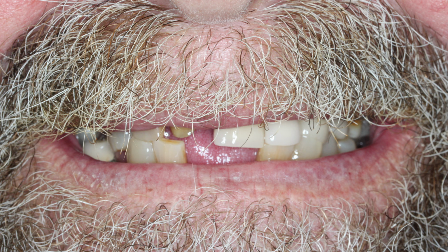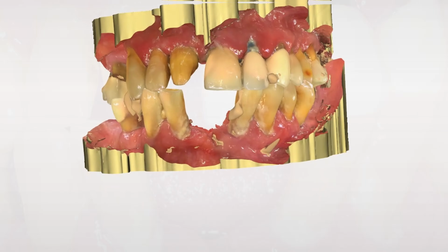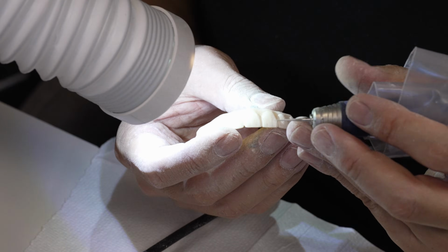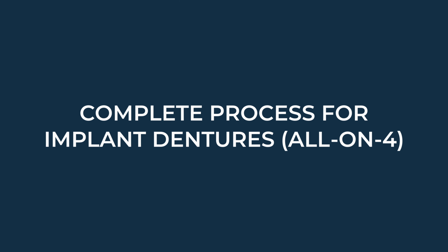In this video, we will quickly go over the complete process for digitally making permanent implant dentures. Here's the current situation in the patient's mouth that we have here today, and we're going to give him a cosmetic set of teeth that look like this in the end. But let's get started with the first appointment.